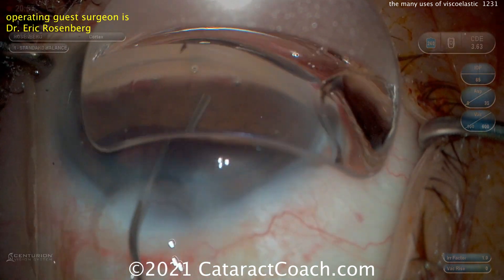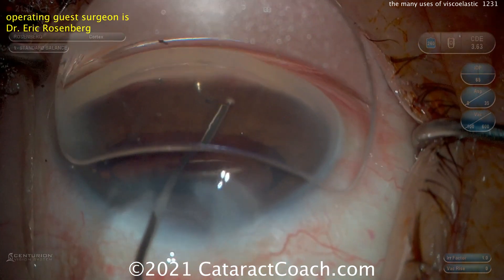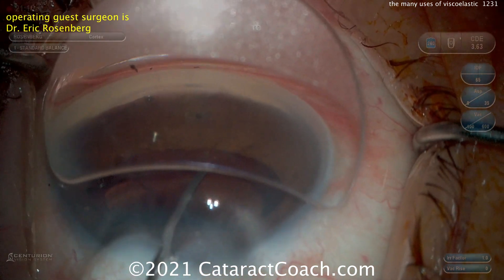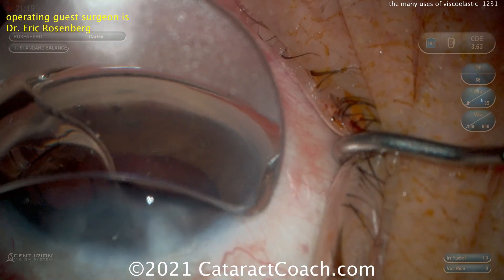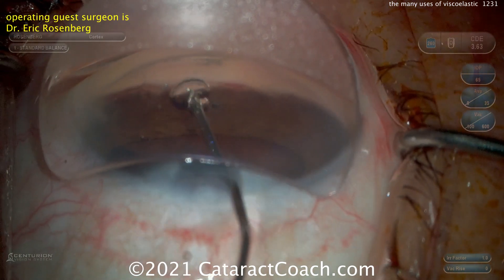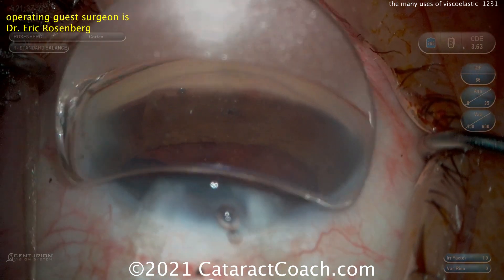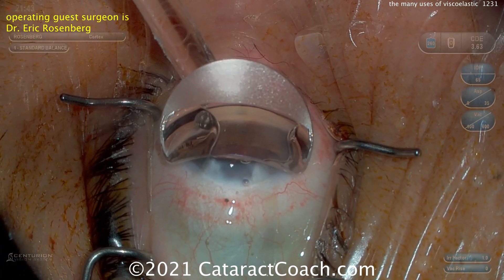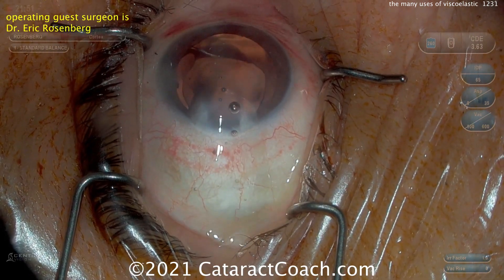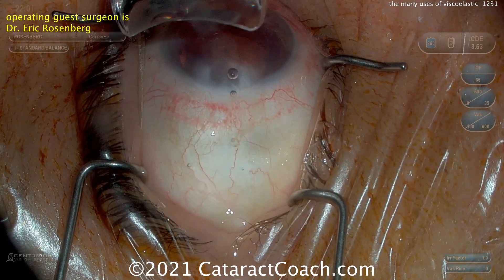So use viscoelastic — use a viscoelastic wave, as he calls it. The viscoelastic wave is going to allow you to bring those little pieces and push them outside the eye. He's injecting at the same time he's depressing his incision, so you're injecting viscoelastic distal to the pieces. Then you depress the incision and it allows the viscoelastic and those pieces to float outside the incision. There they are on the surface of the eye — those can now be removed. Nice pearl there. Again, lots of uses for viscoelastic. Thank you guys for watching.